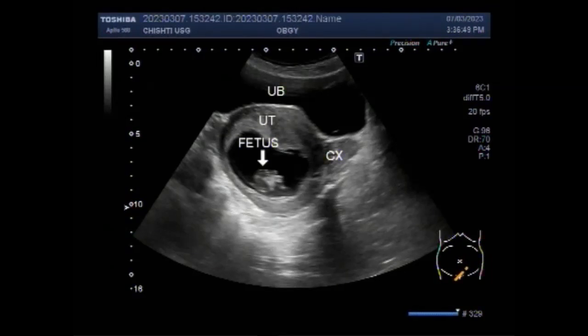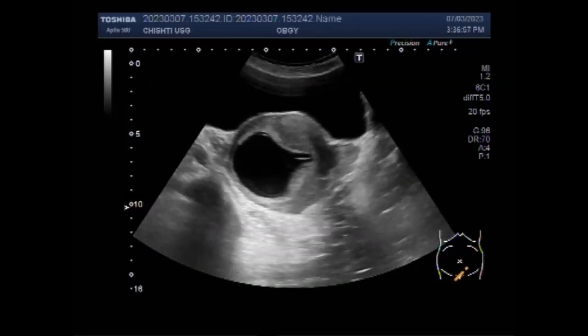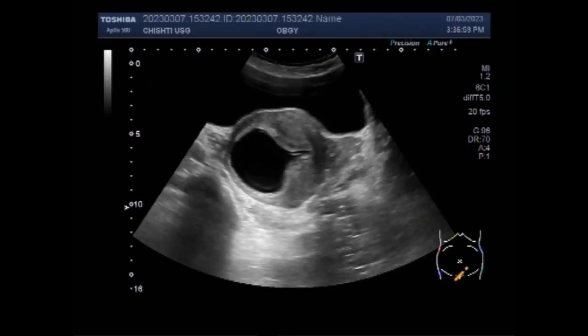Dear viewers, I hope you are all fine. This ultrasound video shows a case of missed abortion, also called miscarriage, with a pregnancy of about 11 and a half weeks.